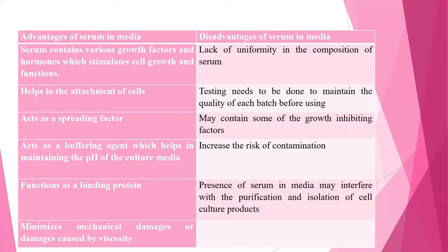Then the next advantage is that it functions as a binding protein. Then the next advantage you see, it minimizes mechanical damage, or damage caused by viscosity. But here, the presence of serum in media might interfere with the purification and isolation of cell culture products. So such disadvantages are also there.